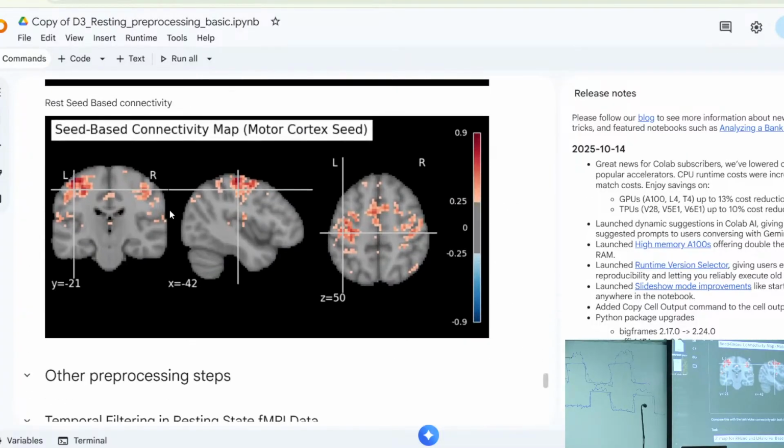Not regarding this, but suppose when I'm doing it on the interface, from the OrthoView Atlas, I open the region and I compare. So that percentage that it shows, this is a probabilistic activation. Where is it acceptable? No one knows the answer to that.